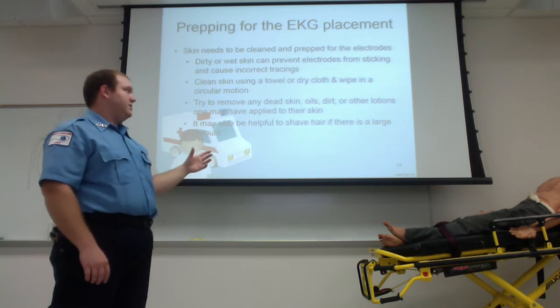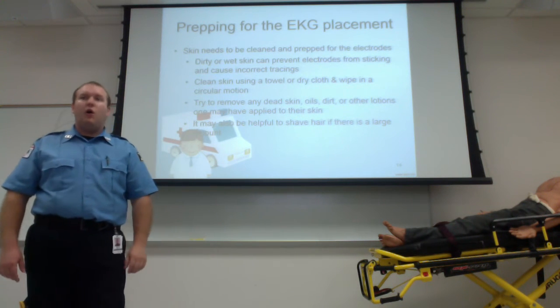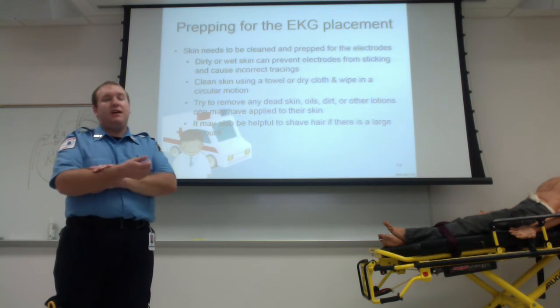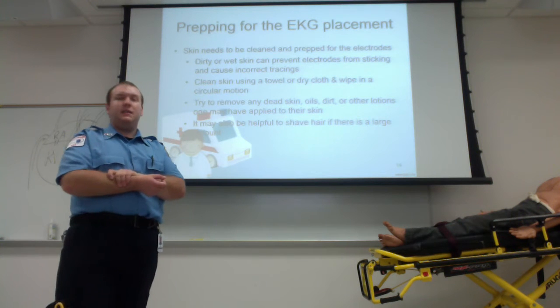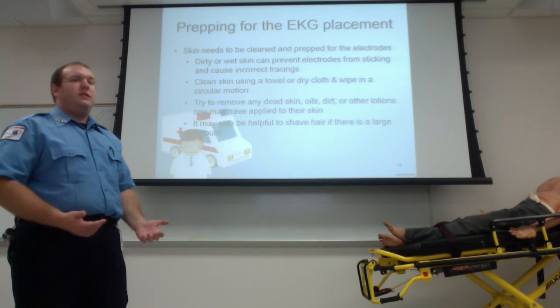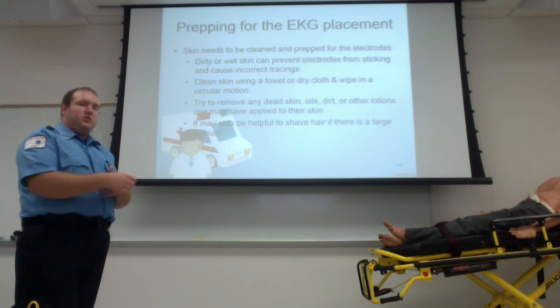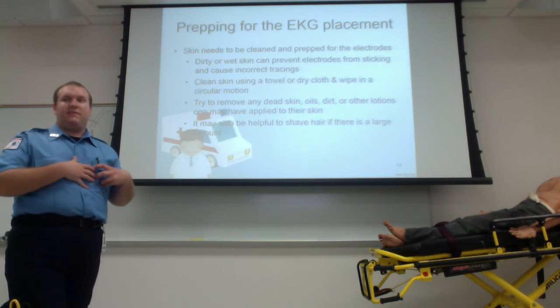Also, if you have a patient who is very hairy, hopefully they don't have as much hair maybe on the inside of their arms, you can find a good spot to stick it. But it may actually be necessary to shave the skin and shave that hair out of the way so you can get a good sticking, a good placement on your electrode. Maybe not as much on your limb leads, but on the chest it might be necessary and very helpful.